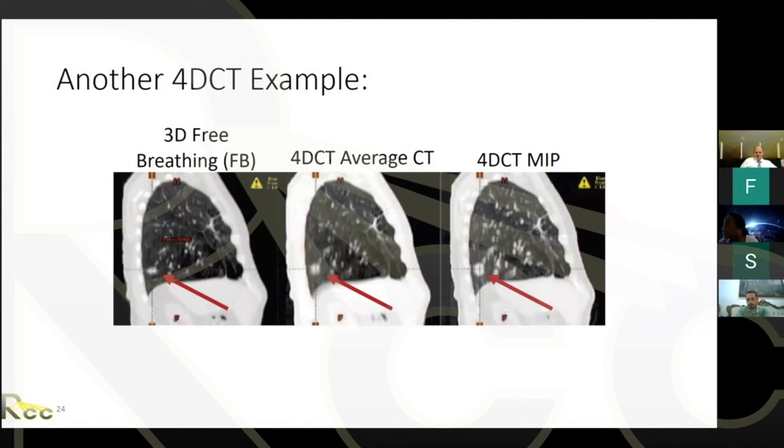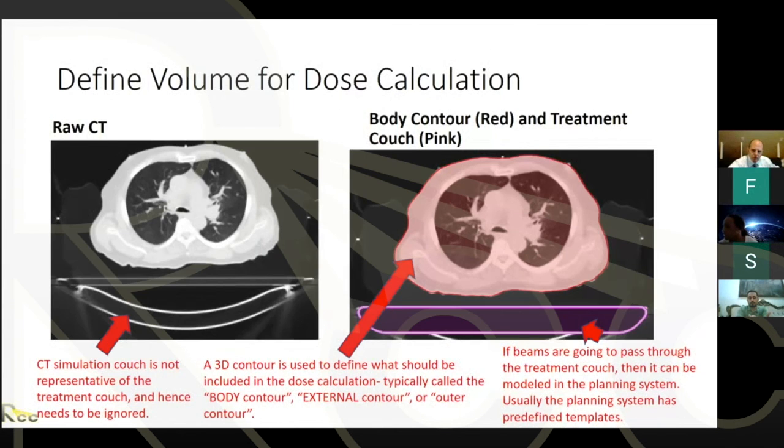Okay, there were two questions earlier, and I took a little bit to answer them. But do you have time, or do you need to leave, Justus? No, that's fine. We can answer them. Okay. So the first question was from Lara, and she was asking, in the example that you gave for naming your CT study, you used special techniques like FB and IBH. I think yours ended with an FB for free breathing. Her question was, what other techniques can you include in that naming?